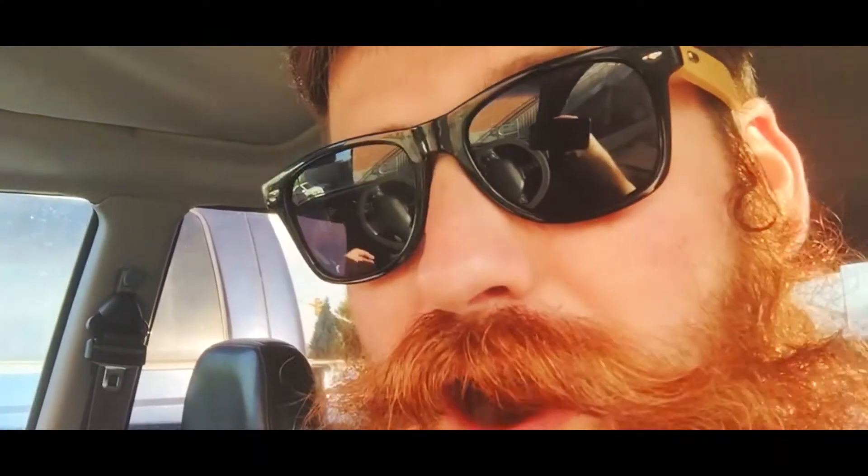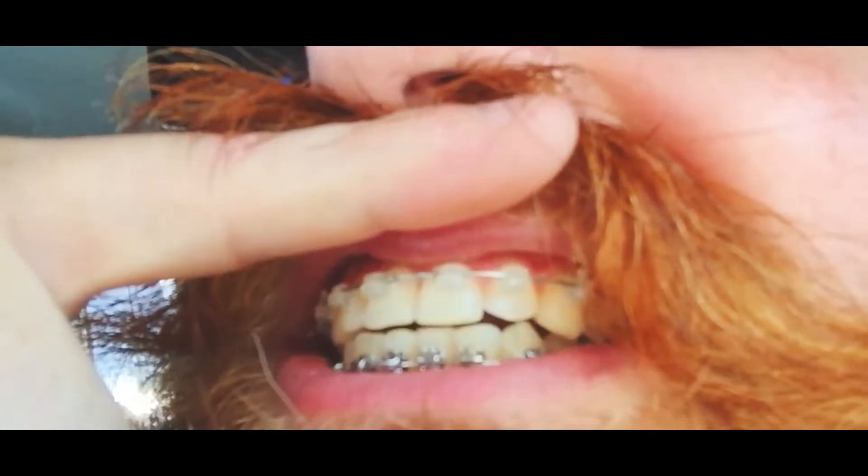So here's the update. They pretty much said that sticking with this wire on the bottom, they are concerned a little bit about the crowding down here. So my next appointment is probably going to be about an hour long and they'll shave off a little bit on the sides of each of these teeth down here just to make that room. The gap that was right there — they put what's called a power chain on it. It's basically like a little figure-eight thing that goes over the bracket here, over the bracket there, and then it pulls it together.